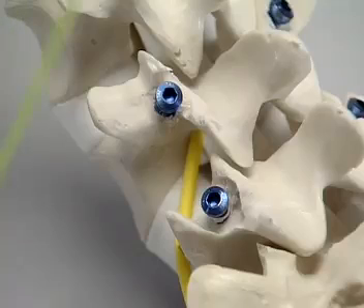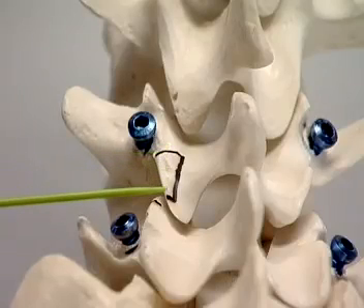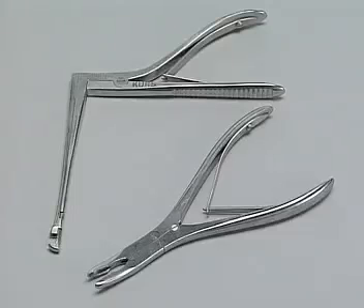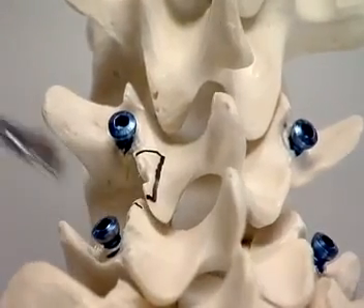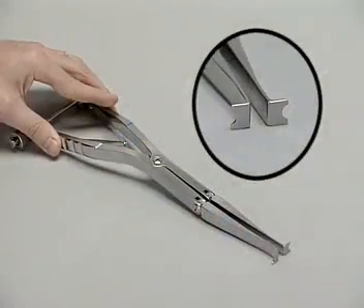Care must be taken not to damage the exiting L4 nerve. This is the position of the window for the transforaminal approach. In this exercise, a laminectomy punch is used to prepare the bone and a rongeur to remove the disc. For distraction, a screw distractor is used.